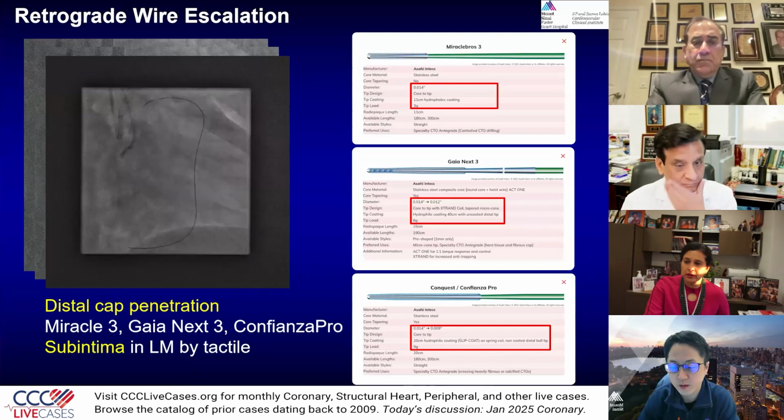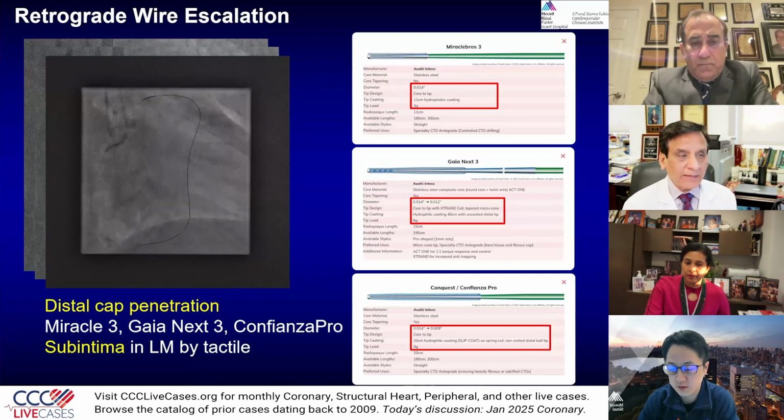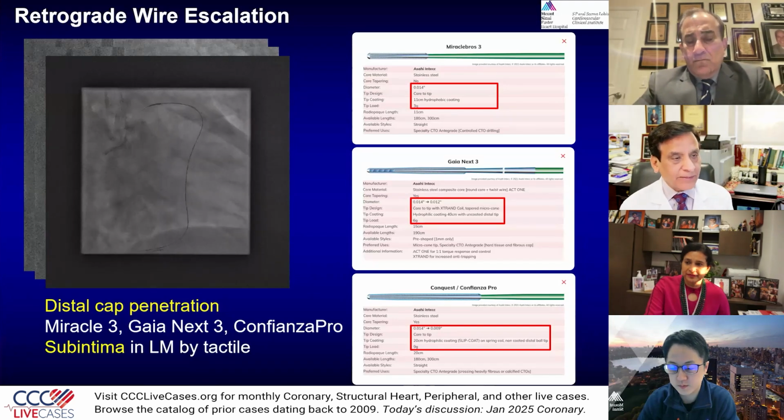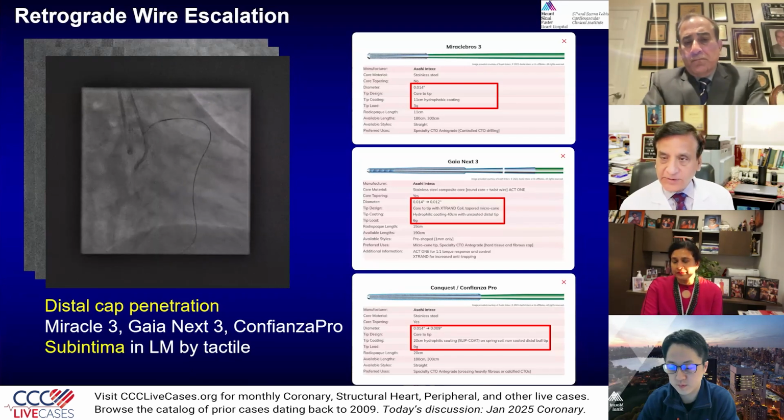What do you say, SS? Yeah. So no, I would say that again, there are some IVUS experts. We are good with IVUS, but there are few who use IVUS in 90, 100% of cases. Maybe they will make a lot of decisions based on it.